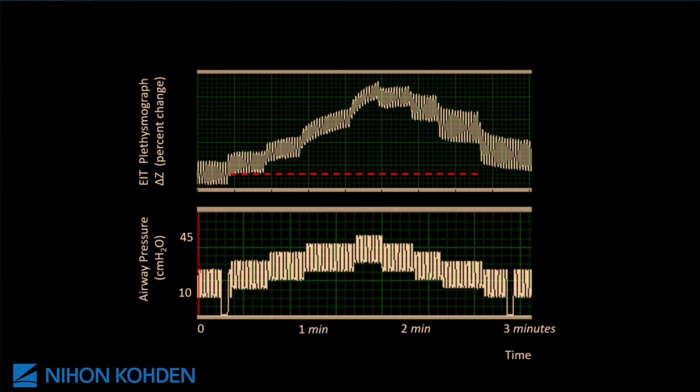You can see that the shape is different from here. Here we see everything symmetrical because we have the same PEEP here and here. But look at the difference in terms of lung volume. When I change from this pressure or this volume to the same pressure in the decremental phase, you see this big gain in functional residual capacity or end expiratory lung volume. At the same time, you can see that there is an increase in tidal volume. And we could not see here in the ventilator because it was not showing the tidal volume, but tidal volume increased. So this means two things.